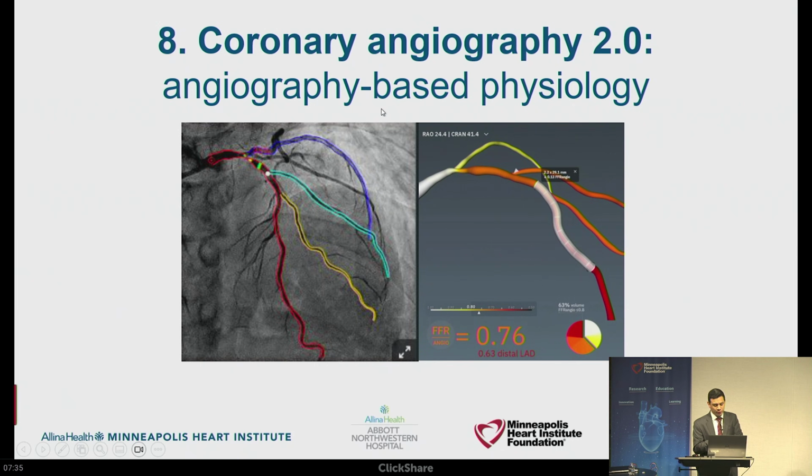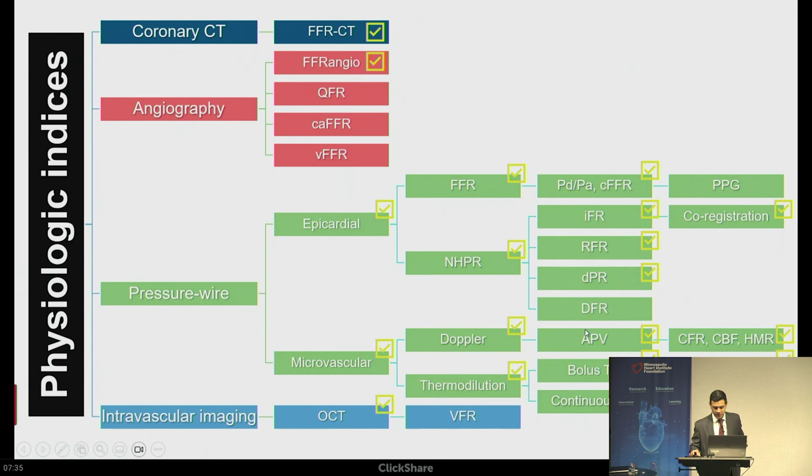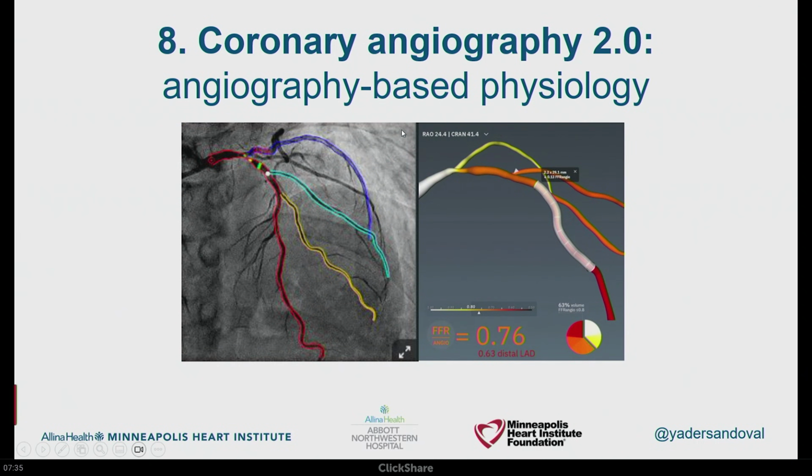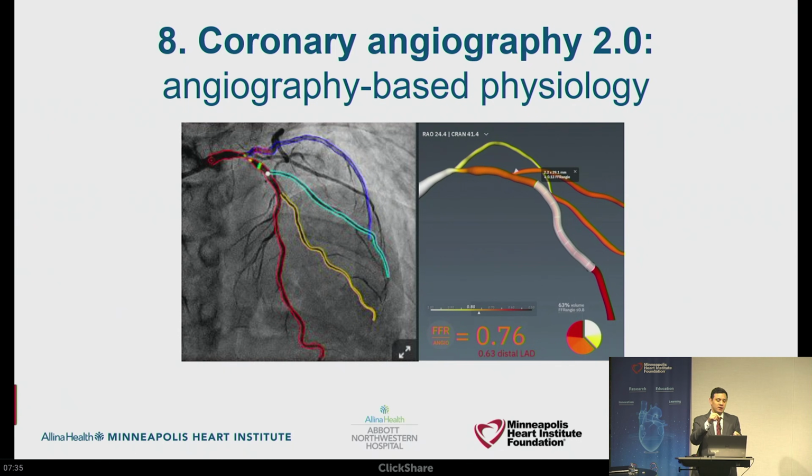Now what is coronary angiography 2.0? As we talked about technologies, and here I'm highlighting something that we have. We do have angiographic FFR. We've had it now for over a year. I think we're the highest place in the state that has done the most angiographic FFR. And pretty much this is now 3D reconstructions of the coronary tree from the angiogram, 3 pictures, and these 3 pictures will create this model, similar to what you say with FFRCT, and from the angiogram, by taking 3 pictures with no panning, they're able to compute the FFR, taking into account that this comes from the DICOM, no panning, good quality opacification, TIMI 3 flow, and they're able to compute FFR.